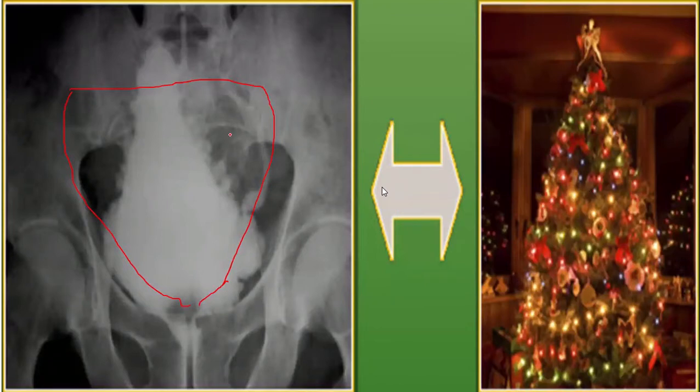So you can see these outpouchings, Dr. Alcover. Can you see this one, Doctor? So these are outpouchings. Meaning that there is a chronic inflammation that has been happening to the urinary bladder, which we call a cystitis. But much more than that, that is something bizarre. Aside from the infection, they also develop diverticula. And then the wall is thickened. This is the wall of the urinary bladder, and this is the mucosa.